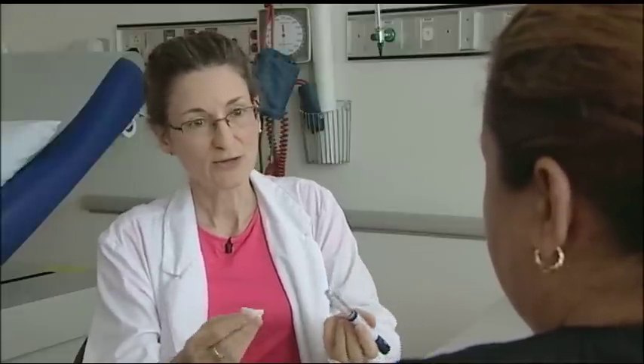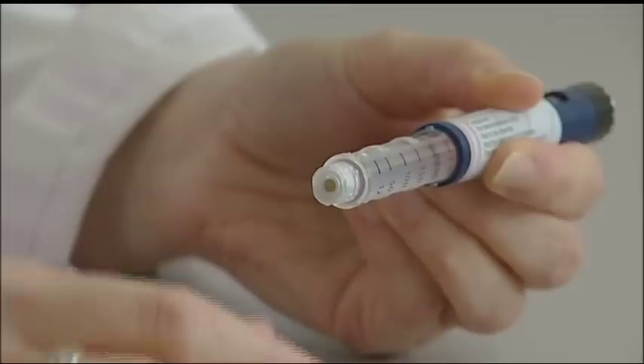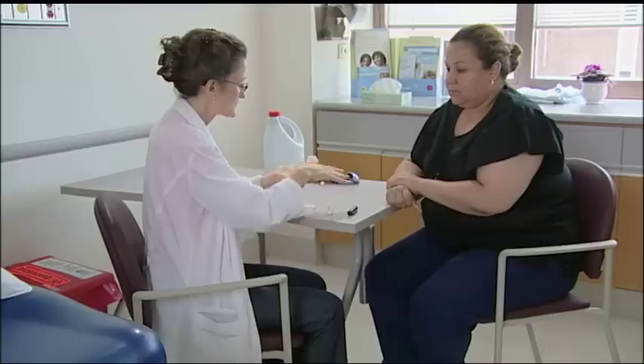To prep your pen, first wash your hands with soap and water, then remove the cover. Take your alcohol swab and clean off the rubber stopper. Your insulin is clear; if you were taking a cloudy type of insulin, you'd want to roll it in your hands or turn it end-on-end about ten times to mix it up.